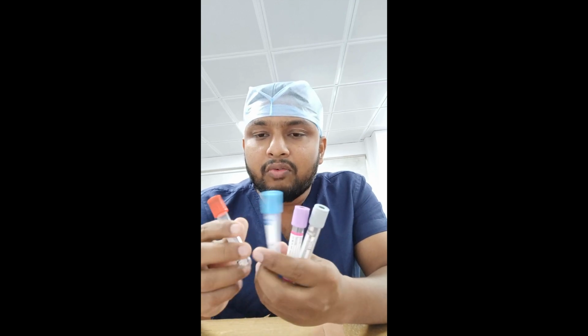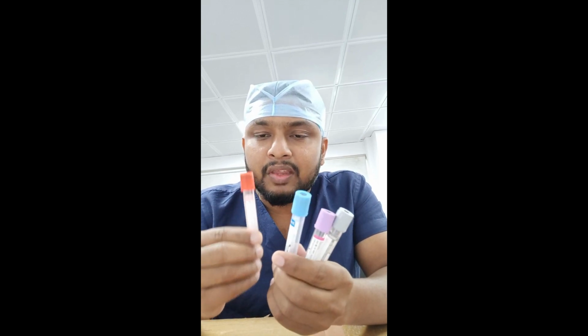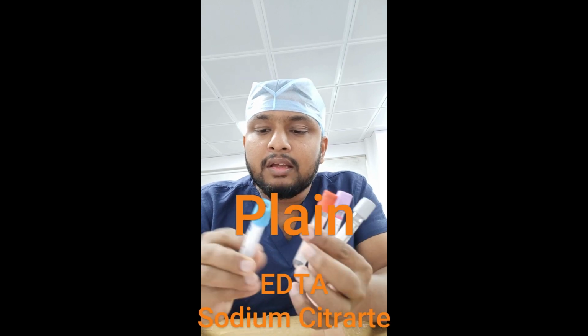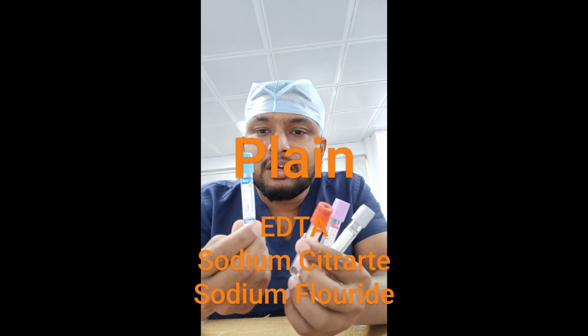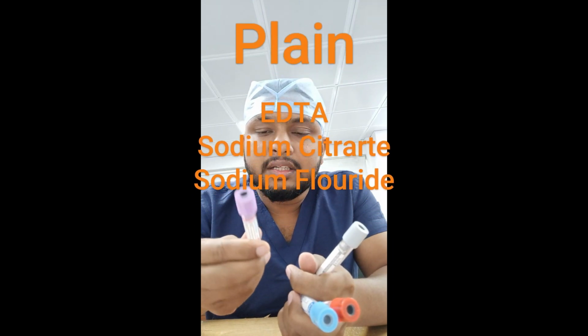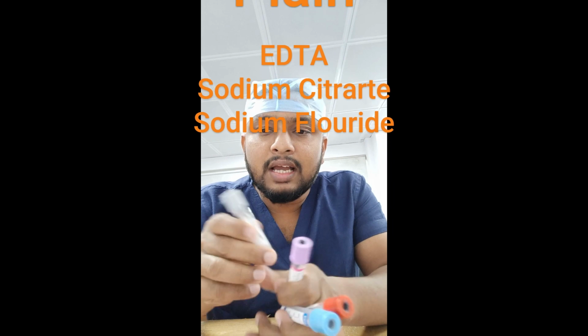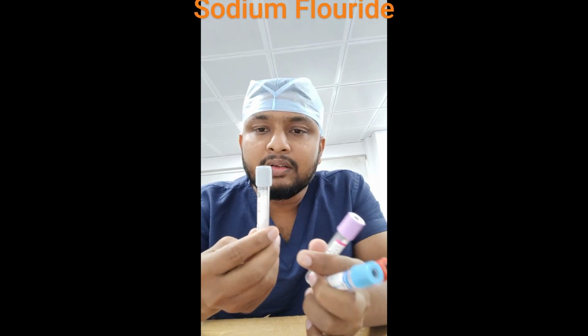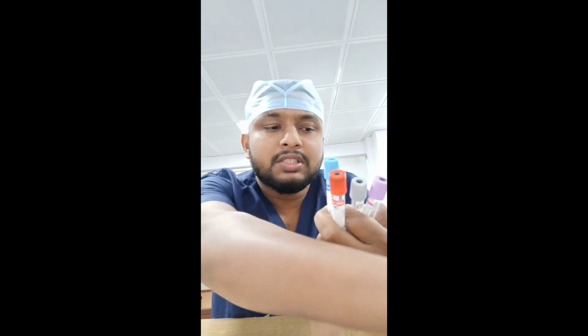So here I have four commonly used Vaccutainers. One is red, also called a plain container. This is the sodium citrate container. This is EDTA, the purple color EDTA sample container. And this ash color one is for sodium fluoride. So what is the importance of each, and which type of blood samples you will send to the different laboratories, all these things we'll discuss.